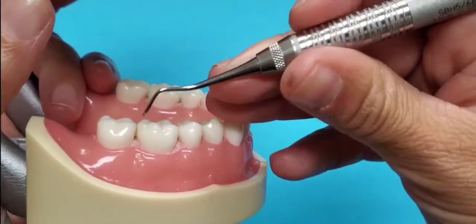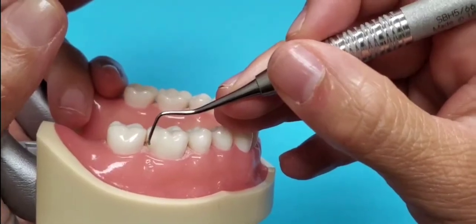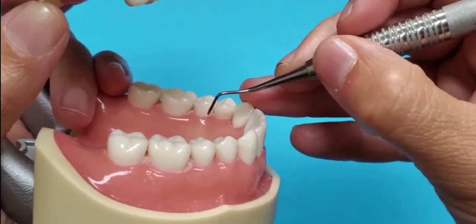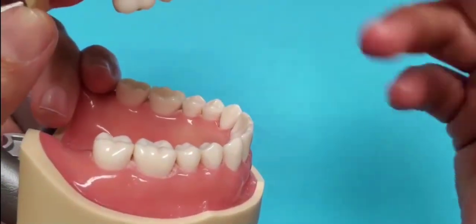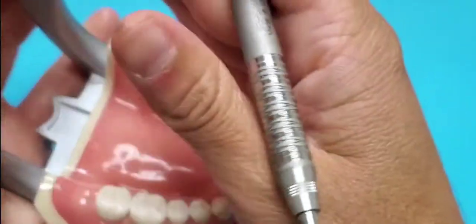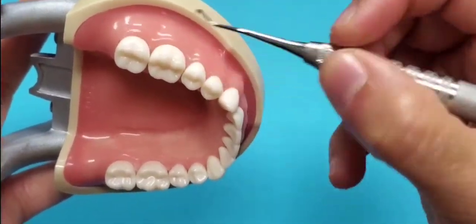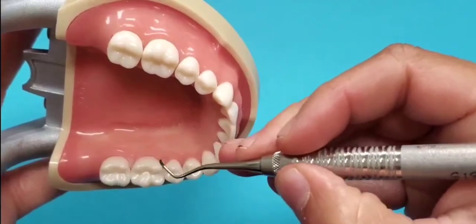This will also be the same end for toward surfaces: buccal of quad 4 and lingual of quad 3. You will need to switch ends for the away surfaces — buccal of quad 3 and lingual of quad 4.